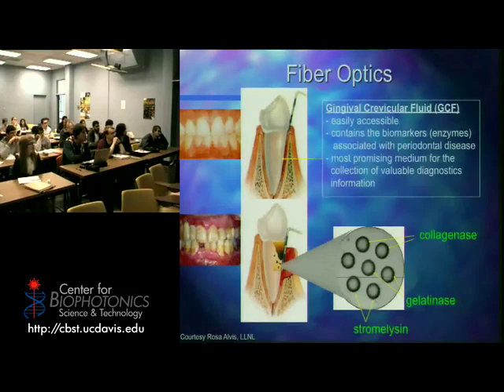And ideally, what you're trying to do is figure out gum disease at earlier stages, so you can figure out ways to treat it. So what she was making is, you see this thing right here? That's that pointy thing that you stick in there, the metal thing.